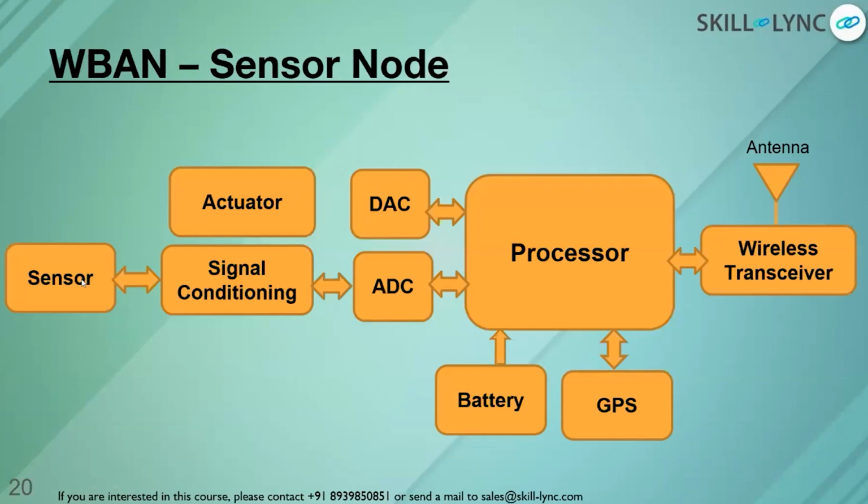So all this time I was saying, we had something called a wireless area network. You had internal processing and external processing. I told you why internal processing is required, because we cannot send too much data. It will take time. In medical, in IoT, in healthcare, time or delay is not at all accepted. All these things I told you. In the same way, you have to understand what will be there inside the smartwatch or a device placed near the patient or near the person.